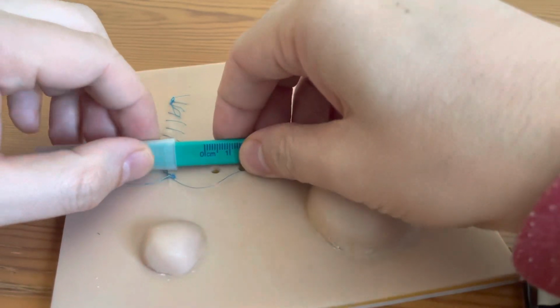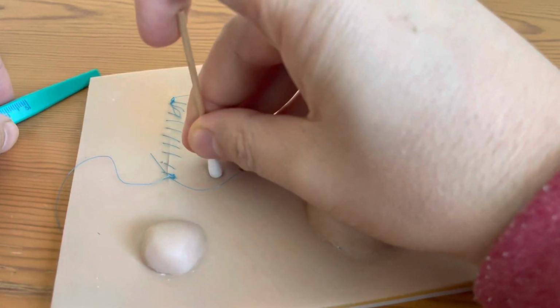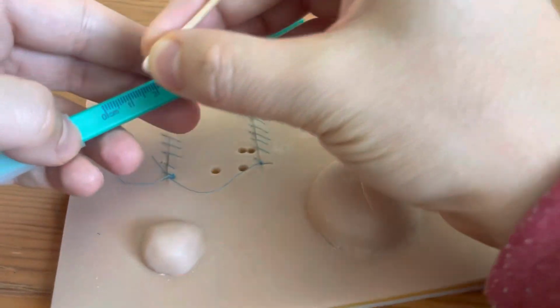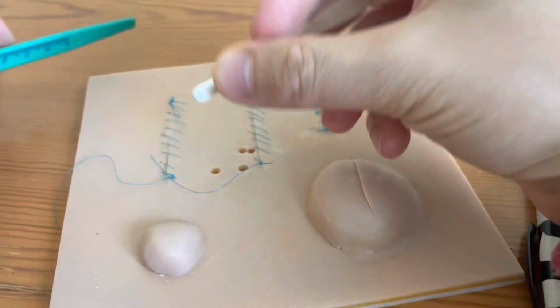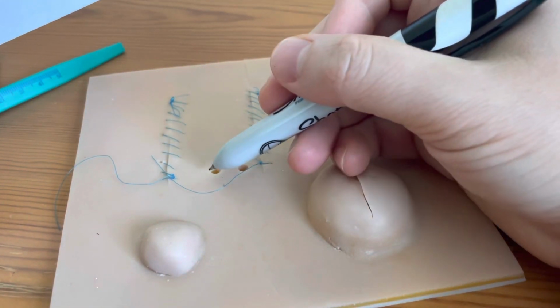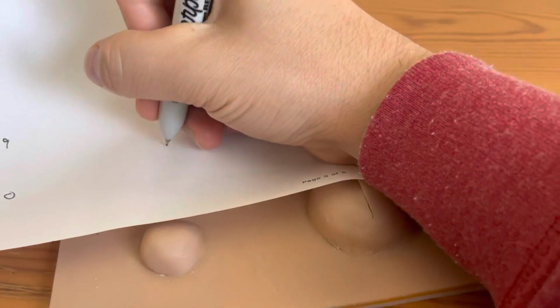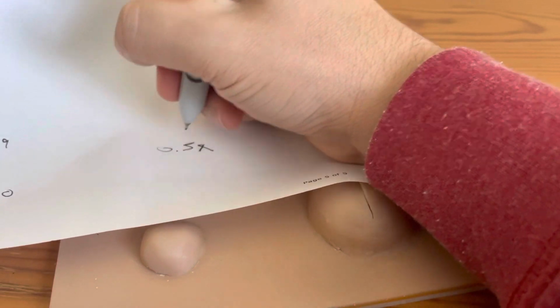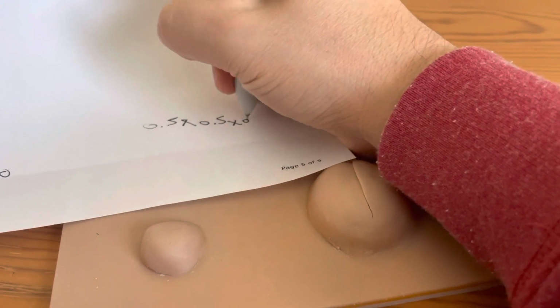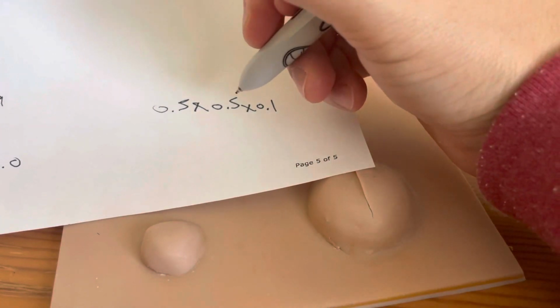0.5. And to measure depth, get a little cotton swab. It's not going to be that deep, but you just place it right there. So let's say 0.1. As you see, I went from top to bottom for length, then width, and then the depth. So 0.5 is the length, 0.5 by the width, and then the depth of 0.1. So that's how you write your less than 1.